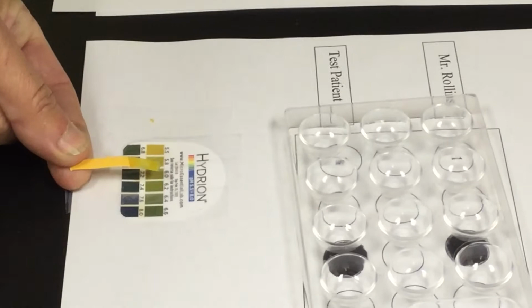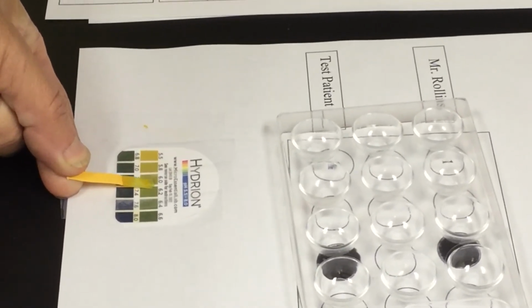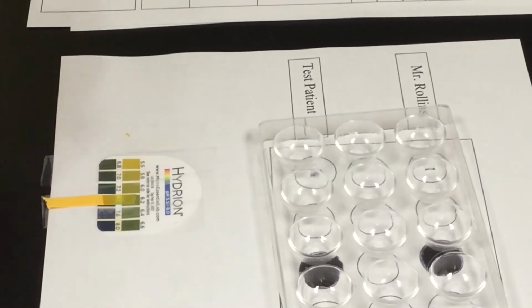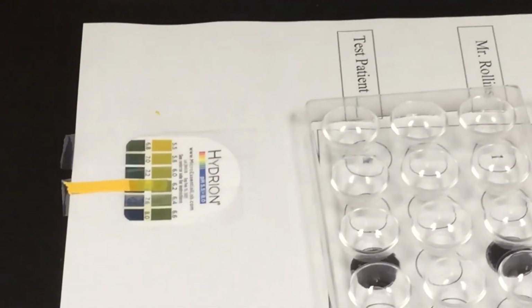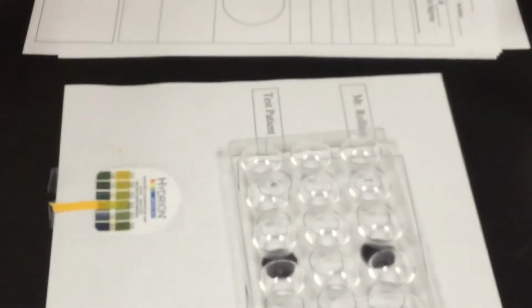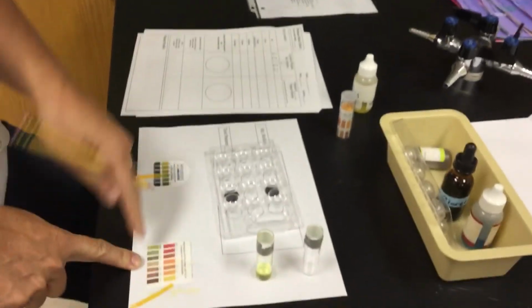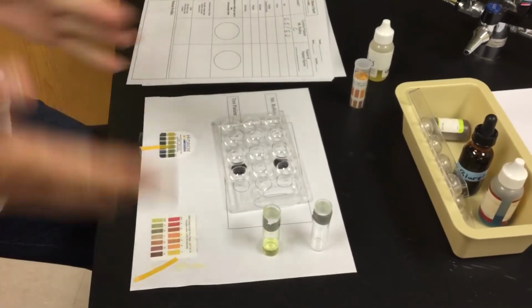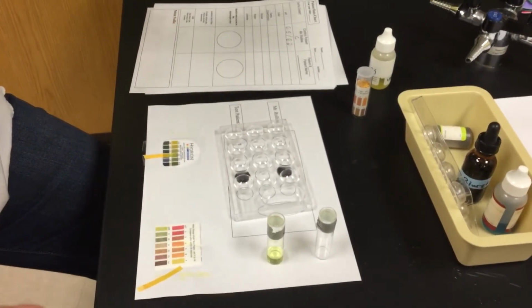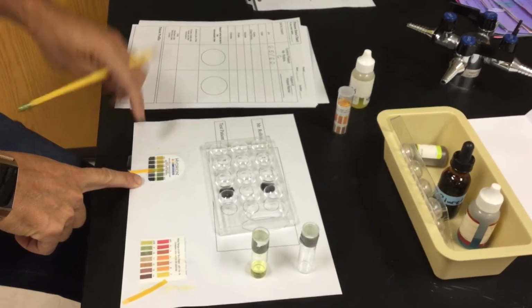So where we said about 6.5, now we're looking at it and I go, okay, well, I'm going to say probably about 6.2. Kind of matches up with that particular color that we have there. So I'm still going to leave my 6.5 for my pH paper. But more specifically, it's about 6.2. I can't tell that with my normal pH paper. I can't go, yep, 6.2, because it only gives me whole numbers. I can go halves, kind of estimate it. The second type is definitely going to be a lot more accurate there.